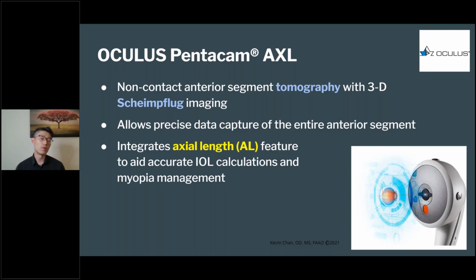Particularly, there are a number of different models of Pentacam. AXL is actually one of the few that is specifically able to integrate axial length features in order to aid accurate IOL calculation as well as myopia management. For this presentation, I'll only focus on this particular model.